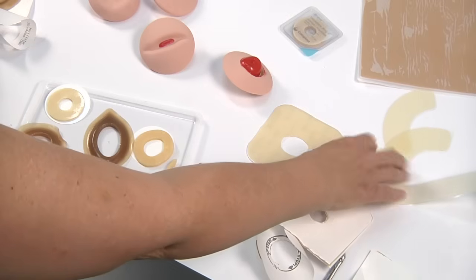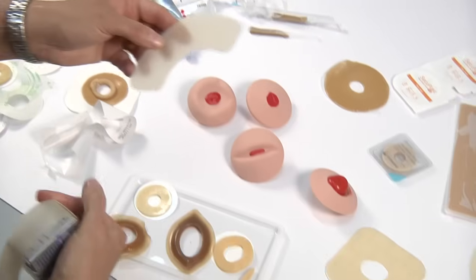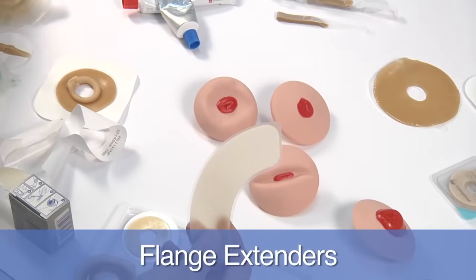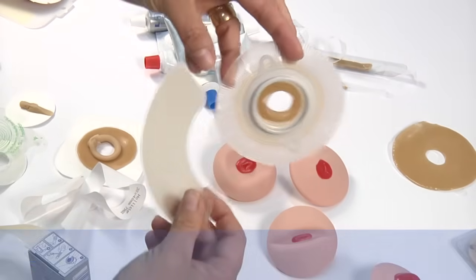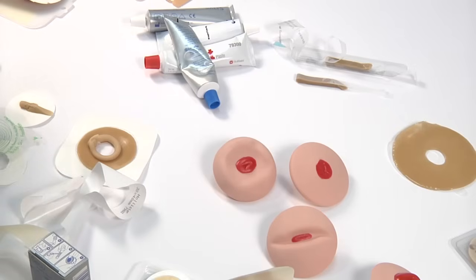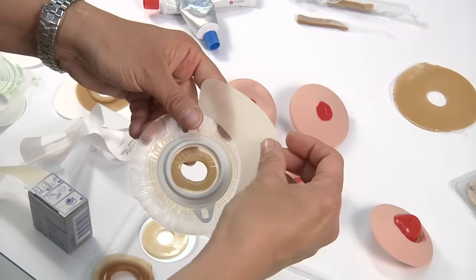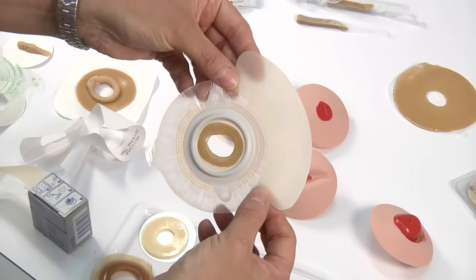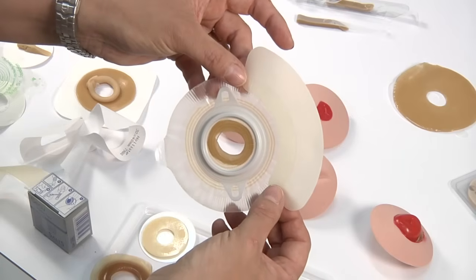A couple of newer options, as far as barriers go, there are these flange extenders, and these go on the outside of a barrier. So if you've got somebody like this who feels that they need to have their barrier extended, you would take this extended or half moon shape that's preformed for you, and you would apply it to the outside of the barrier like this. It may require 2 or 3 depending on the size of the barrier to go around, and these are probably running around $1 to $1.25 each.